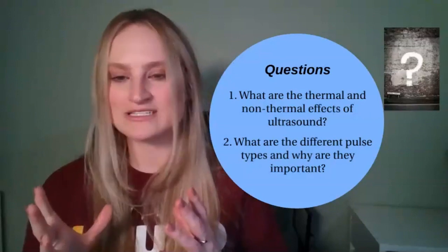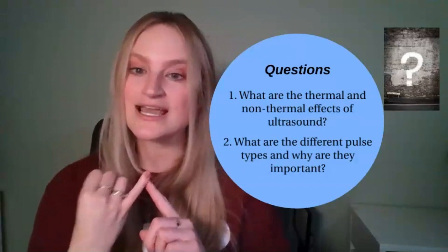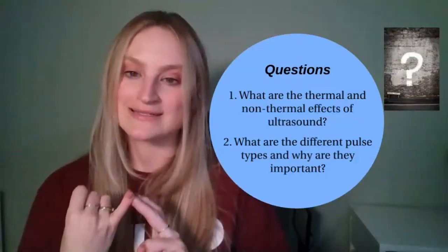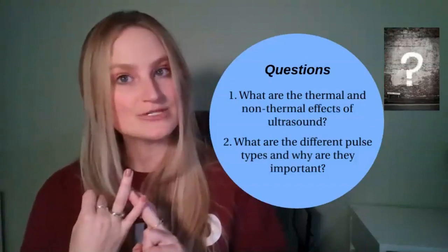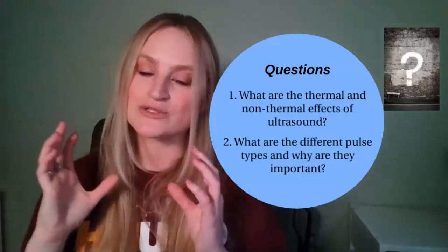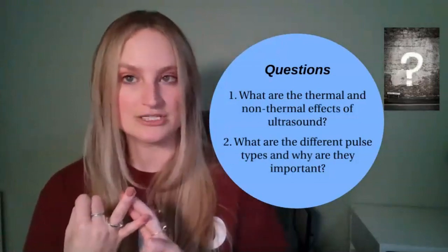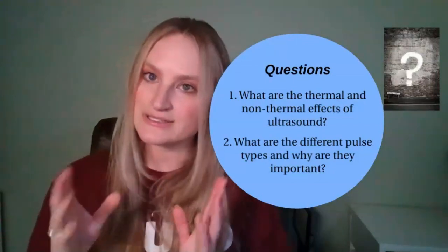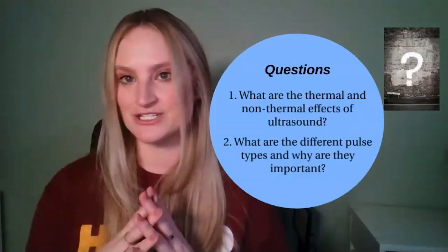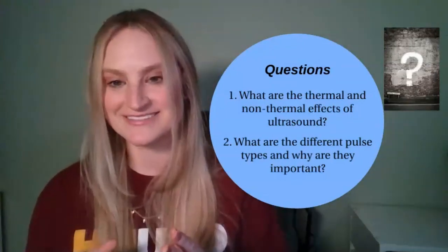Secondly, what are the different pulse types and why are they important? Well, there are two types, pulsed and continuous. They describe exactly what they do. Pulsed mode has breaks in between the sound, and continuous mode is constantly producing sound. Pulsed mode gives us mostly non-thermal effects. It reduces inflammation and increases collagen. On the other hand, continuous mode generates thermal effects with deep heating by stimulation of the tissue. Both types have benefits and can result in pain reduction.